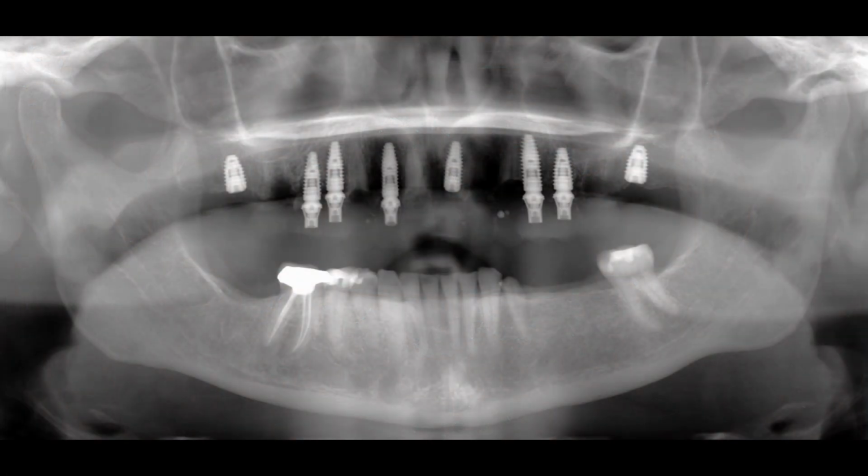So this is that particular day. Because the number 10 implant failed, we placed an implant at number 9, but the number 9 implant was not strong enough to accept the temporary that day. So the temporary now has a long span across the front, and that is not a good thing, mainly because she's a grinder clencher. But also, if you look at her lower teeth, she doesn't have premolars on the left side, and all of those forces of biting are right there where the temporary bridge is unsupported. She did break this at least once while she was healing.